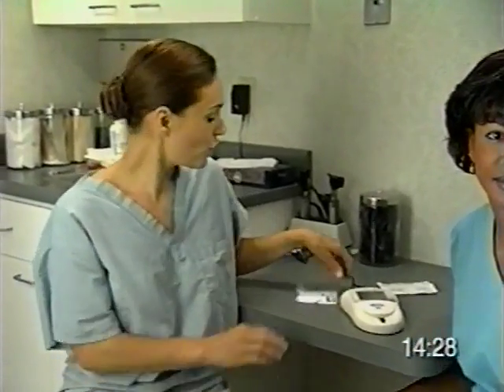One of the most important parts of testing is getting a drop of blood, and the Coagucheck Safety Pro device helps ensure that you consistently get a good drop. You will receive 5 Coagucheck Safety Pro samples in your care kit. Additional quantities are available from Roche.